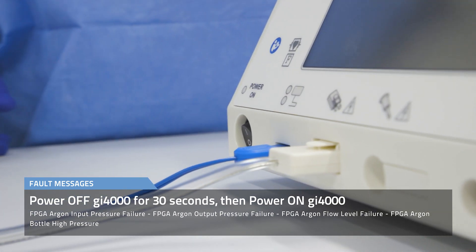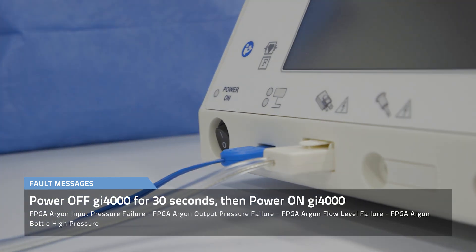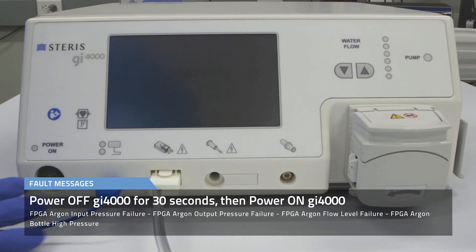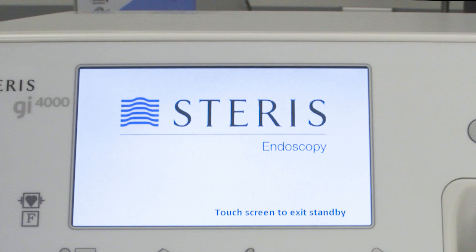In the event one of these fault messages appear on the system display, power off the GI-4000 for 30 seconds. Power on the GI-4000. If the fault message does not appear, continue operation.